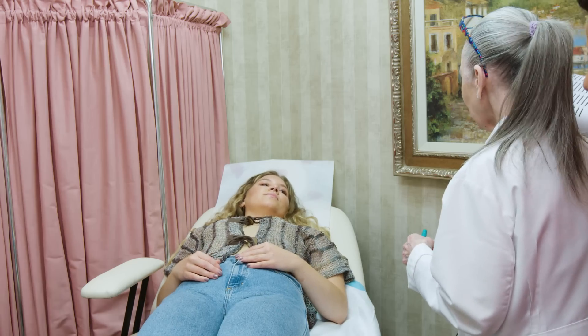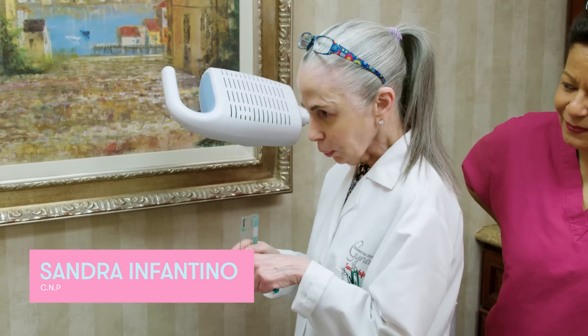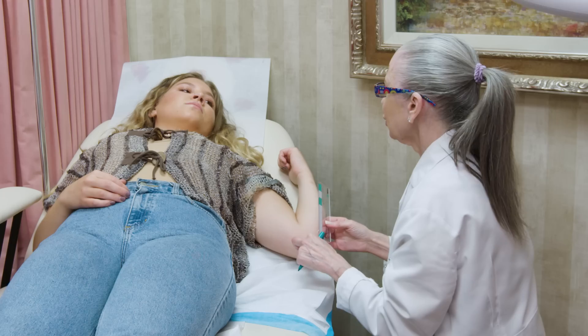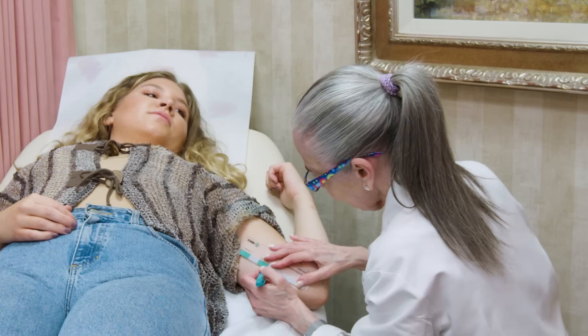The first thing I'm going to do is measure the exact site where I want to insert the implant, so I'm going to make a little mark. We can insert the device during the first five days of your cycle, or any time after that as long as I'm sure you're not pregnant. And your pregnancy test is negative today.